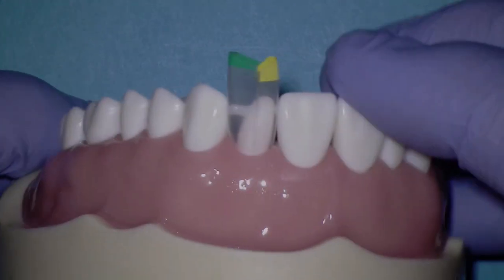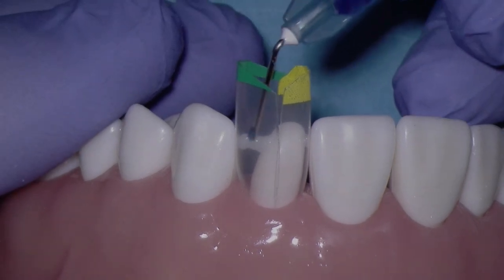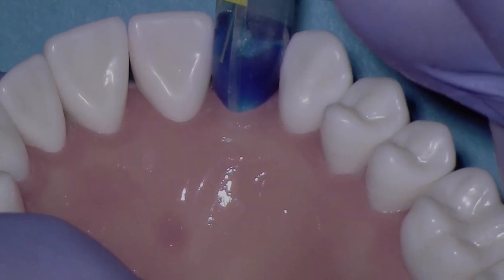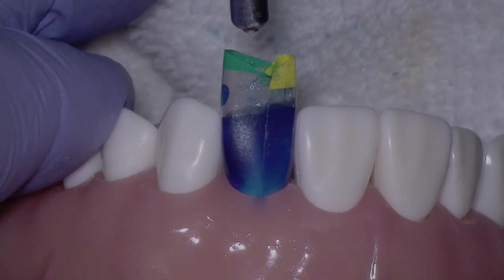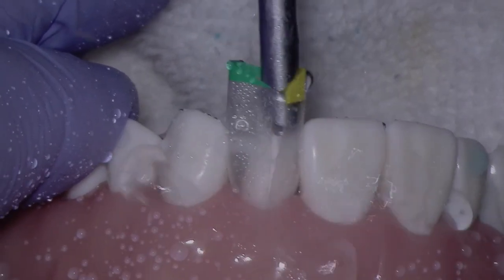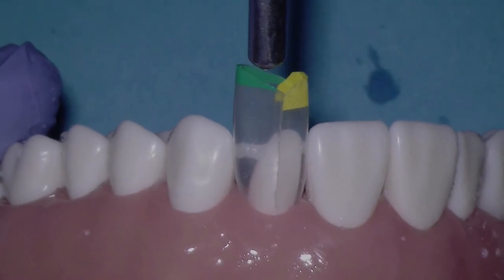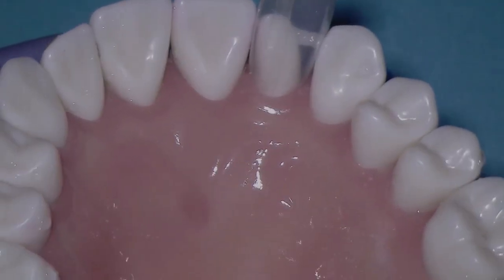Let's go ahead and acid etch. So we acid etch everything for 15 seconds. Make sure to reach under the contact areas to get complete etching. Always check carefully to make sure that all of the phosphoric acid is gone after rinsing. Use your mirror on the lingual and do a very careful visual check. Let's check both the facial and the lingual to make sure all the blue etchant is gone.